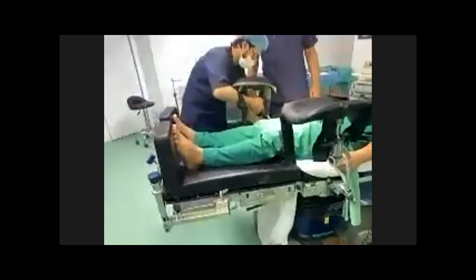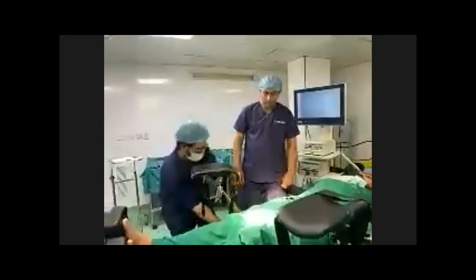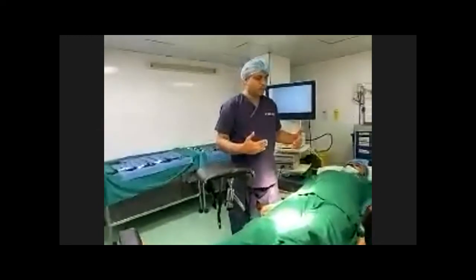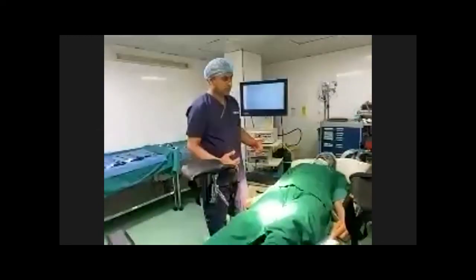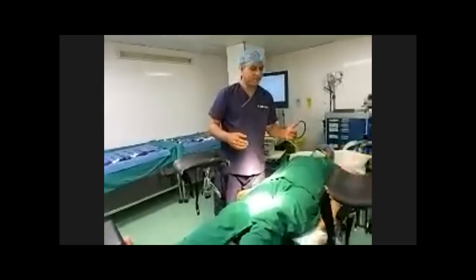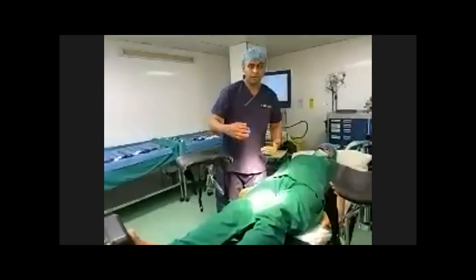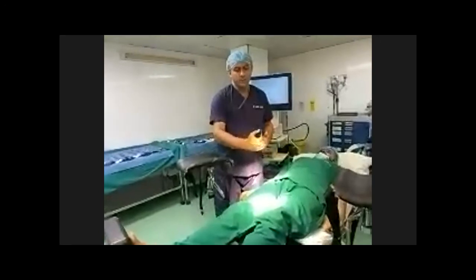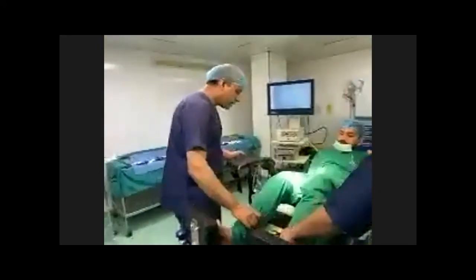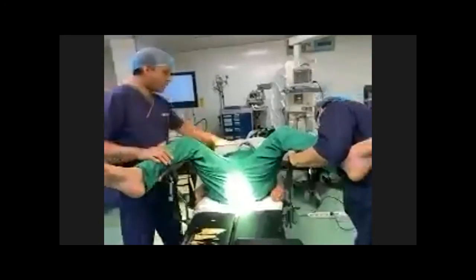So we are making a lithotomy position while performing laparoscopy. If you are doing a left hemicolectomy, or performing APR laparoscopically, you stand at the right end of the patient, and you have to make a lithotomy position in some cases. If you are performing a laparoscopic hysterectomy, usually you stand on the left side of the patient, and you have to have a vaginal manipulator, a uterine manipulator, put in through the vagina, and you have to make a lithotomy position.